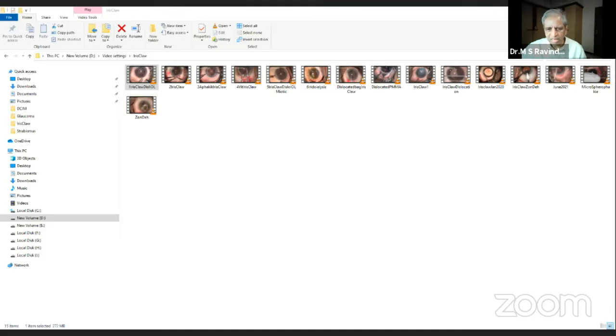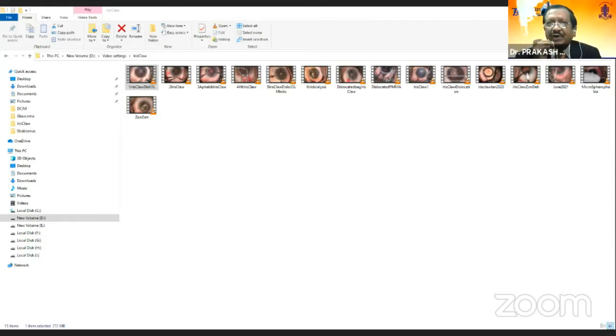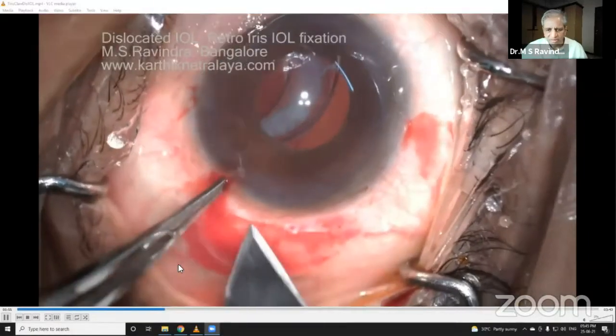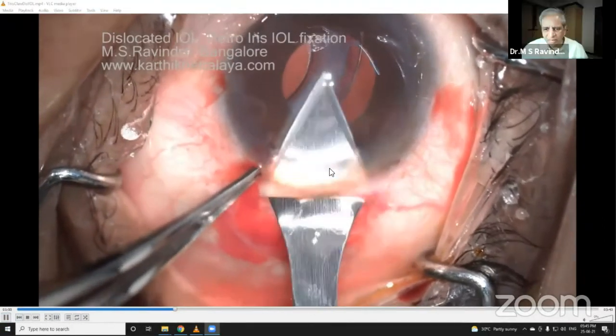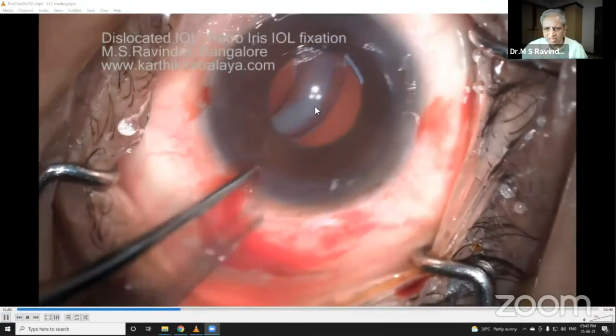Make an adequate size incision — if you struggle through a smaller incision... the video had not started, but now it's sharing. So I made a sclerocorneal incision; that's the dislocated capsular bag.